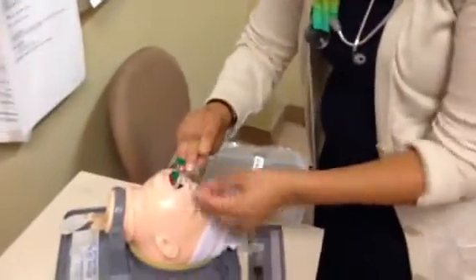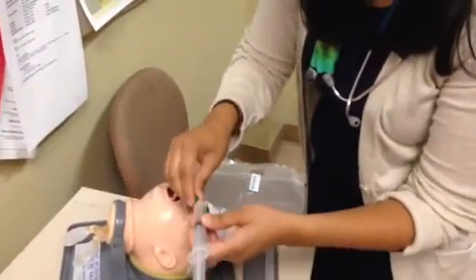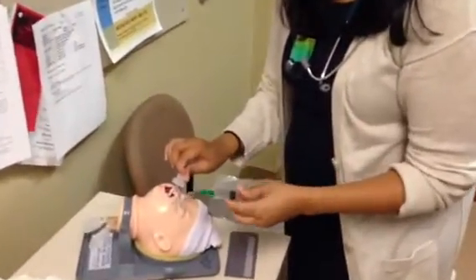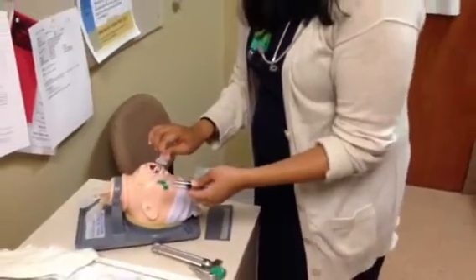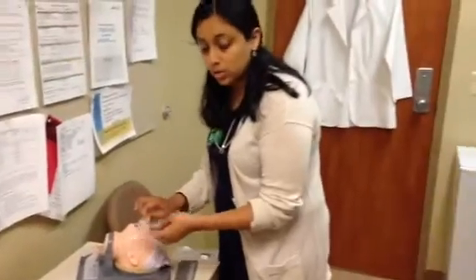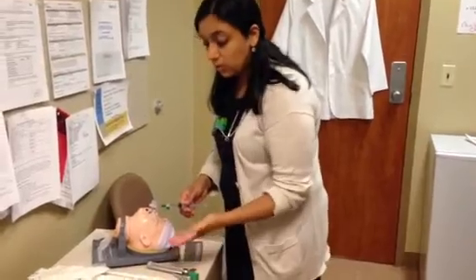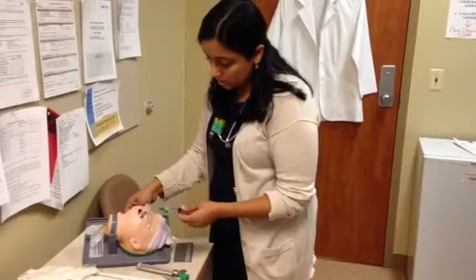And then I need a second person to take this syringe, and we're going to pop it onto this NG tube. I'll just do it myself here. So this person's still holding this. Second person does this. And then what we will do is half of this dose, so of the 6 mLs, 3 mLs will be inserted the first time, and then we'll reposition the infant, and then the second half of the dose, the other 3 mLs, will be inserted during the second half. So for the first half, the infant will be turned either right side or left side up, it doesn't matter. But for this instance, let's turn the infant right side up.